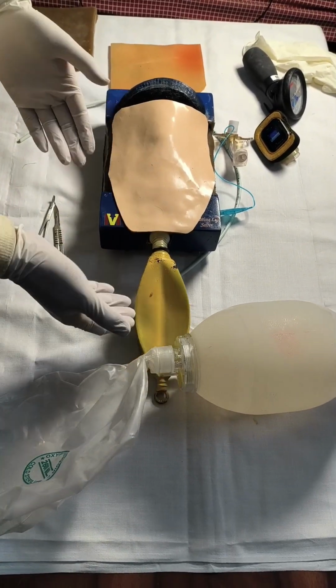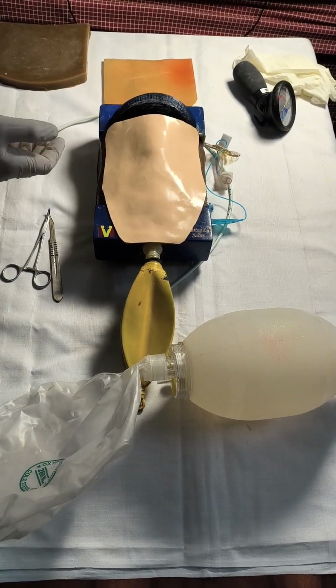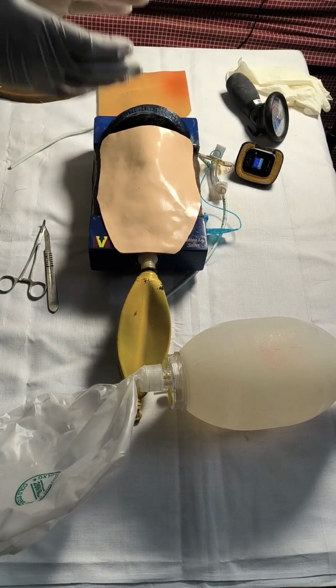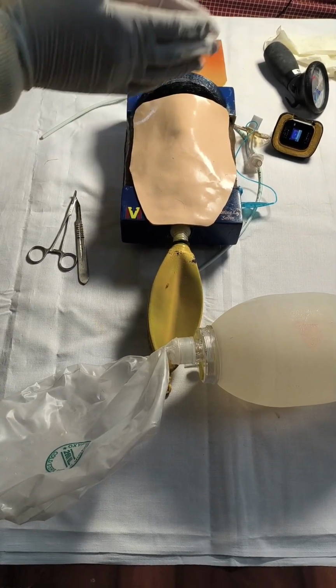Here you will get that bladder inflation, and then you put EtCO2 and then confirm. So that's one way of doing deliberate practices. That is mental visualization or mental rehearsal.